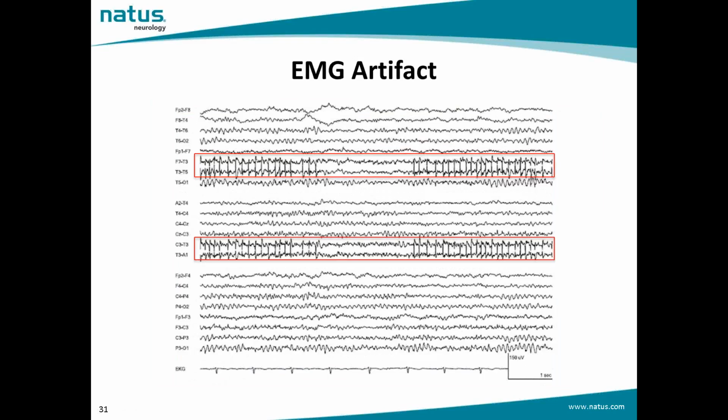Here we have an example of EMG artifact that mainly differs from the muscle artifact because the potentials recur with nearly fixed interval and without significant change in waveform. In addition, this is typically limited in distribution to one electrode, T3 in this example, and in duration, which is briefer than epileptiform spikes.